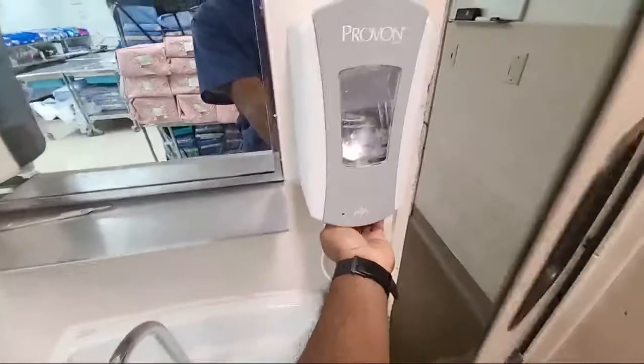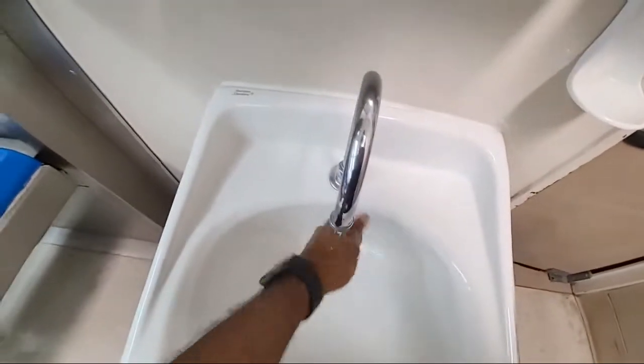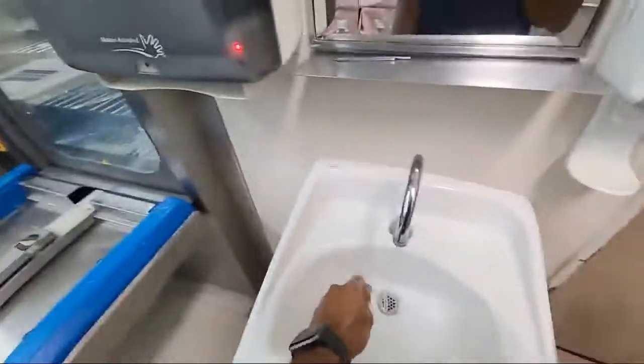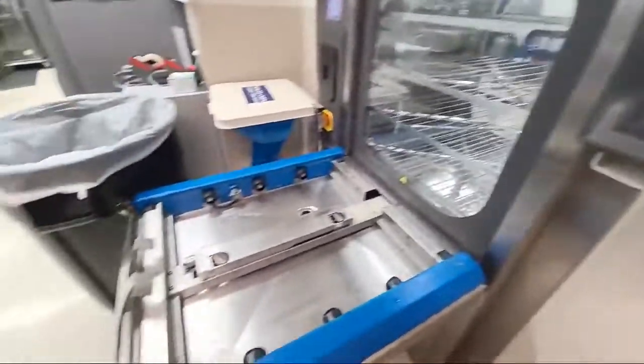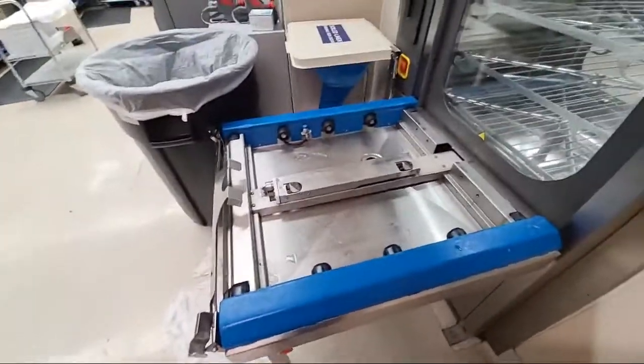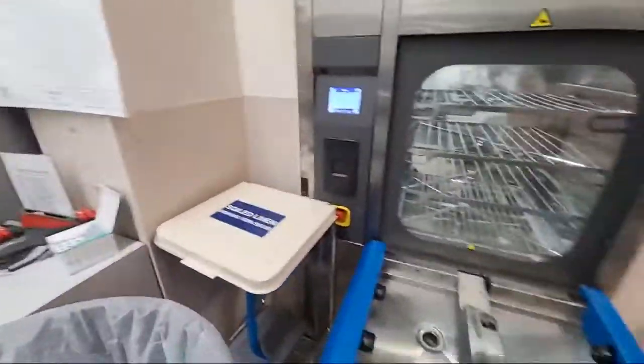And after we go through from decon, here's our little midget hobbit door. We go through here. And here's the sink where I'm going to wash my hands because I touch stuff. Something just fell on my foot. Oh no, this is a foot pedal. Okay, that's good. And then the stuff comes out on this side. It automatically opens the door and pushes it out. If there's something here, it won't push it out, and it yells at us. Beep, beep, beep, gets everyone's attention, and we fix it, and then it's calm again.